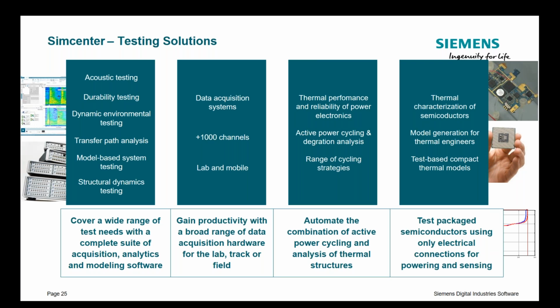And applications for thermal analysis also exist for two types of inputs: failure statistics and degradation analysis, to combine the tests for power cycling and thermal tests for reliability data and heat flow path changes, for things like general semiconductor thermal measurements or LEDs and thermal interface materials.